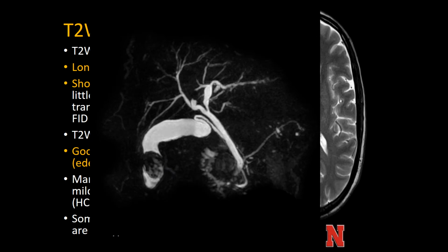This is kind of an extreme example, the MRCP sequence. MRCP sequences are basically heavily T2 weighted sequences, to the point that the only things you see are fluid, in this case bile within the biliary tree. It's a great way to look at the gallbladder, cystic duct, intrahepatic bile ducts. We use this to stage cholangiocarcinoma. You look at pancreatic cysts to see whether they're connected to pancreatic ductal side branches or the main pancreatic duct. Very useful MRCP images, just heavily T2 weighted.